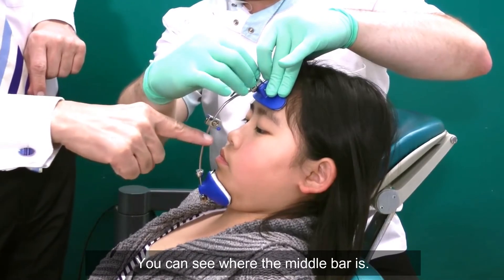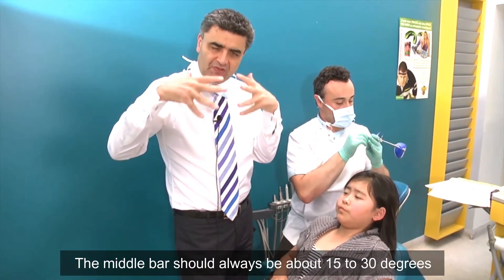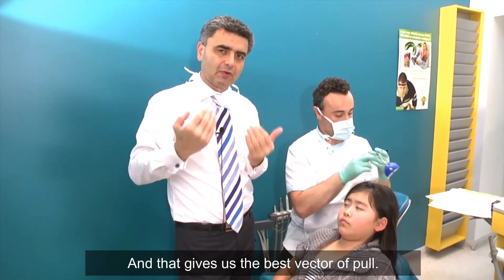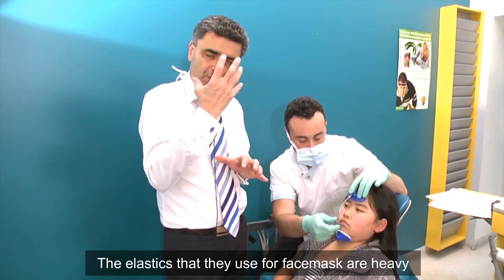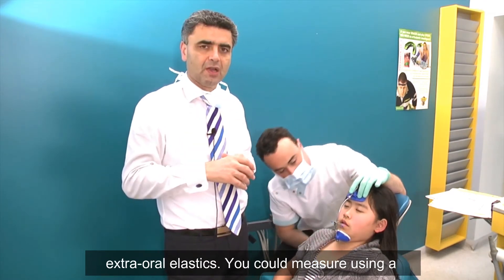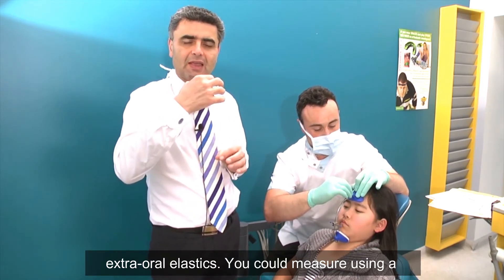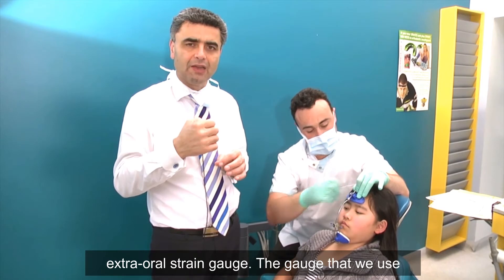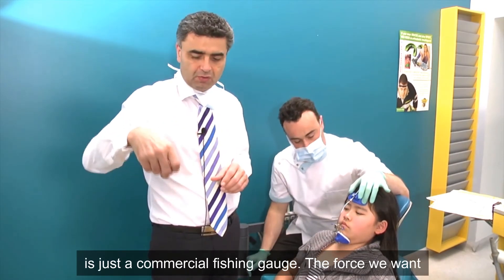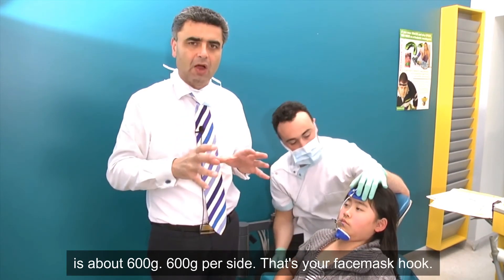You can see where the middle bar is. The middle bar should always be about 15 to 30 degrees downward and forward of the occlusal plane — that gives us the best vector of pull. The elastics used for face masks are heavy extra-oral elastics. You can measure using an extra-oral strain gauge; the gauge we use is just a commercial fishing gauge. The force we want is about 600 grams per side.